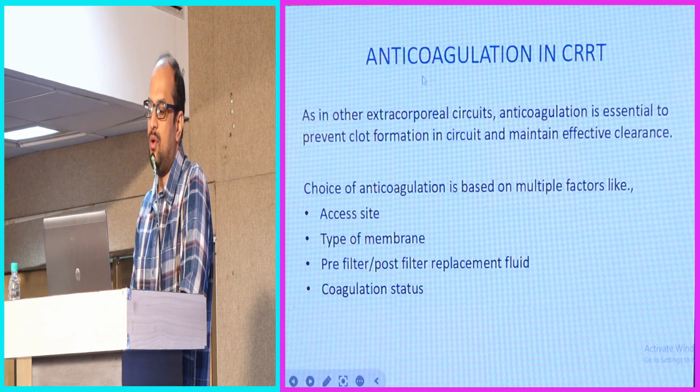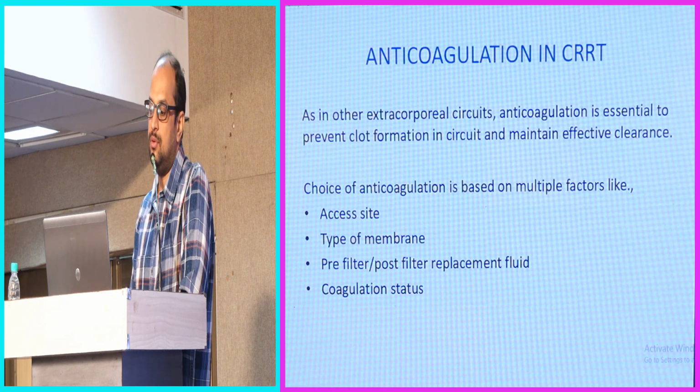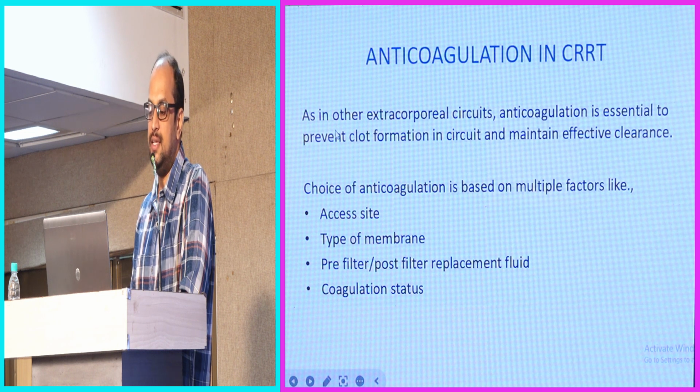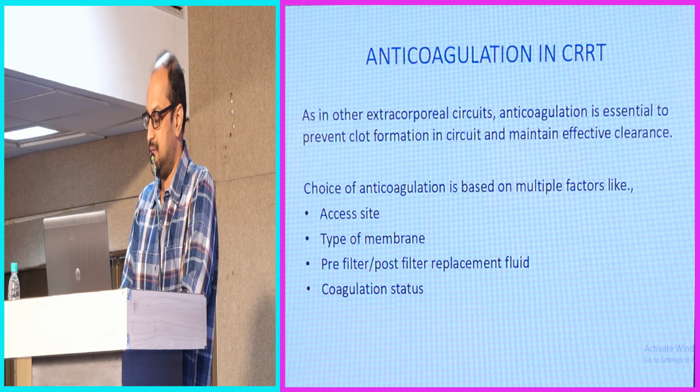So what is anticoagulation in CRRT? As in many other extracorporeal circuits, anticoagulation is essential to prevent clot formation in the circuit and to maintain effective clearance also. The choice of anticoagulation depends upon important factors like access site, the type of membrane that we are using, the modality of the replacement fluid, whether we are giving it in pre-filter or post-filter form, and the coagulation status of the patient.